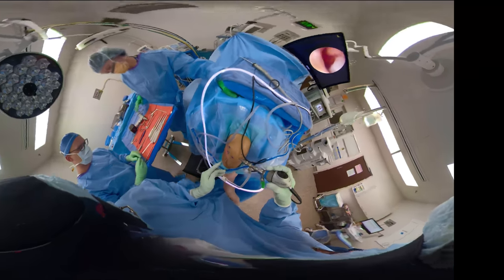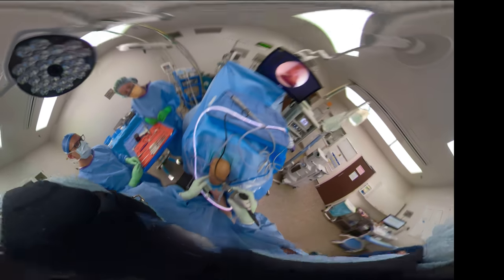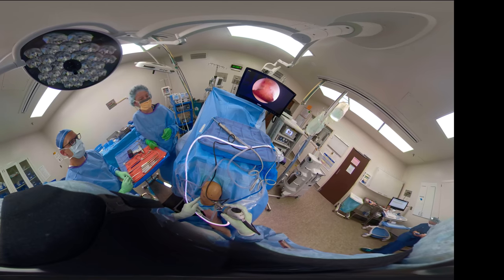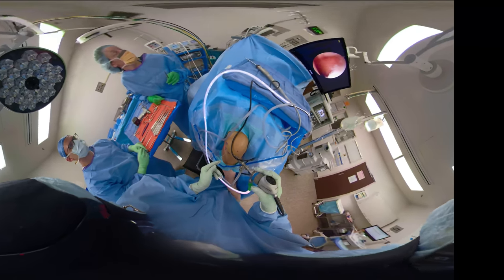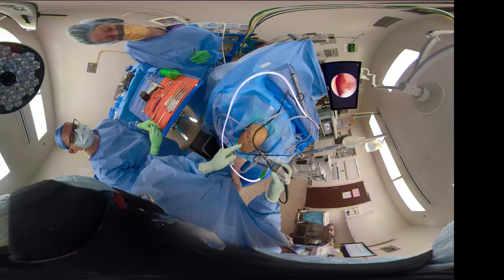And we'll up the table, got to make sure your mayo's out of the way. And so now when I'm looking at this, I want to be as perpendicular as possible, so we might have to flex the knee a little bit more. It is good to make a little bit of a skin stab incision because you don't want the stainless steel to make a tattoo on the skin. So you can see here where I'm triangulating. I'm keeping my scope still on that lesion. And see how I've come down a little bit.